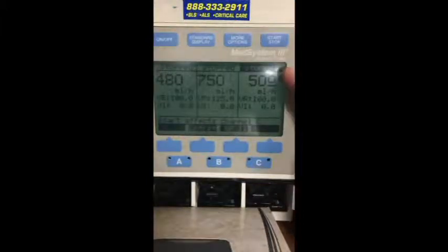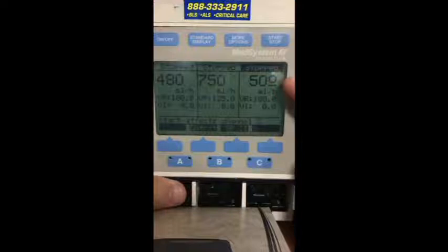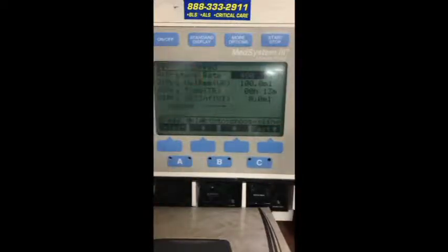You can see which channel you're in right now because it'll be highlighted. So if I hit the start button, it's going to be in the highlighted one. I can hit the start and stop from the home screen. We can see the status of infusing or stopped on the top. So if I wanted to start or stop this one, it's highlighted, I can do that, but I can't on the home screen. I would have to go in and select channel A and then hit start, and it'll tell me on top infusing or stopped.